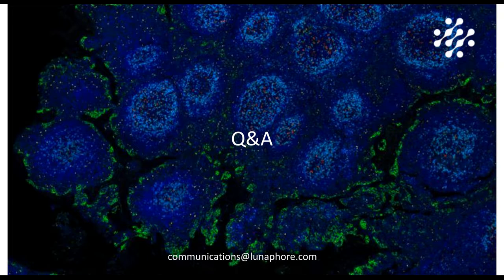And at the same time, in parallel, I think we are also working on completely different applications. So we would like to adapt the platform to sequential immunofluorescence techniques. So sequences of regular primary, secondary fluo-labeled antibodies with imaging protocols in between each staining, which is a technique that can enable to reach much higher plex than multiplexing TSA. So this is currently under investigation.